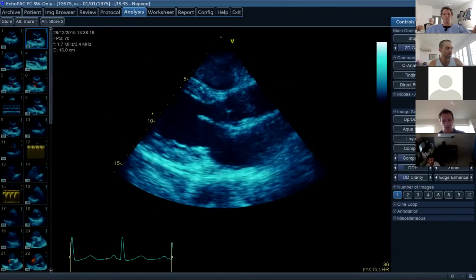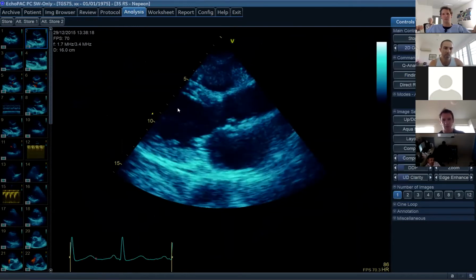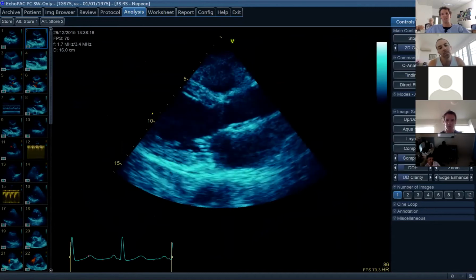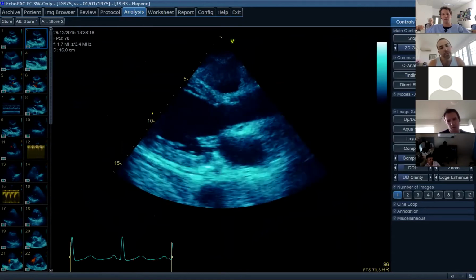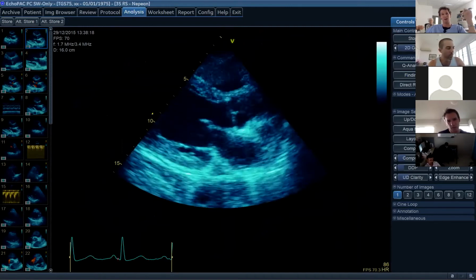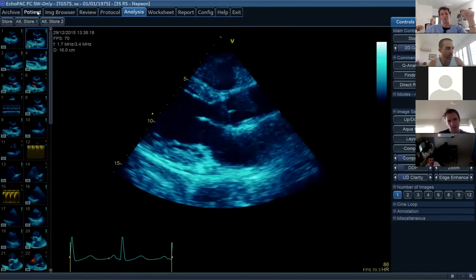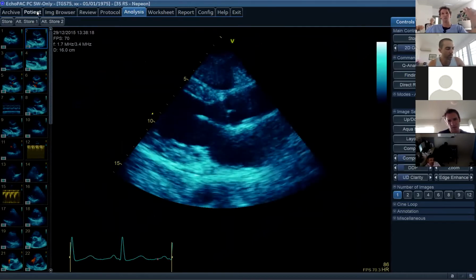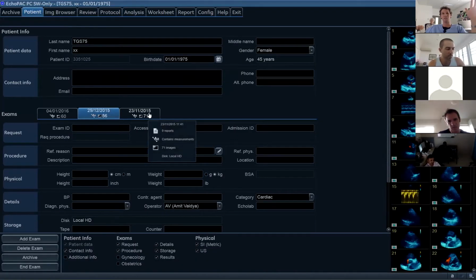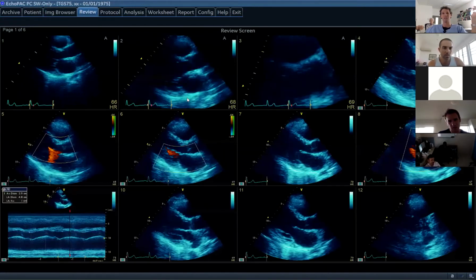I'm really sorry, I've shown you actual follow-up studies, so it was even worse than that. I've shown you the wrong one. So this is the study just after she came into the unit. Here you can see the LV function is clearly down, and the point you just mentioned is perfect, because I was able to include her in the study because I knew this was acute. This was done on the 29th of the 12th, and it was about a month ago that we had the pre-chemo echo study done.